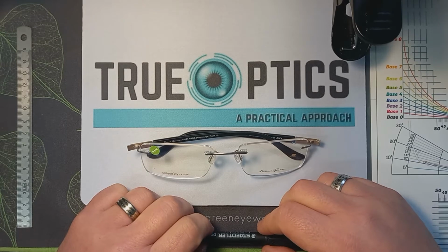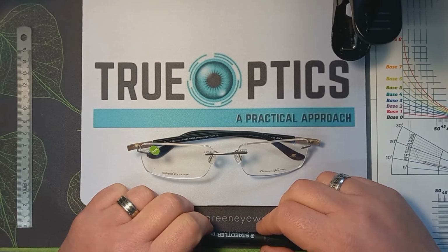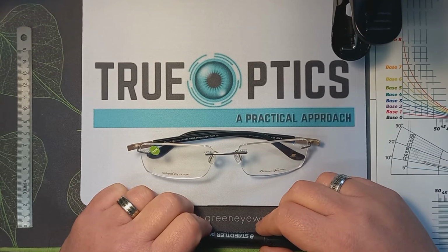Guys, for the purpose of this video, I'm going to take my patient PD, which is 65, and divide it by two to get a mono PD. This is not the right way of doing it in practice. Always remember, once you take PD measurements from your patient, make sure you measure mono PD. It's very seldom that your mono PDs are going to match each other. It's very seldom that the right eye is equally apart from the left eye, from the center of your patient's face. So always make sure to measure your patient's mono PDs.